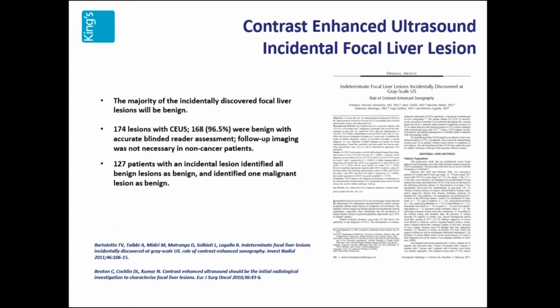And it's important to appreciate that in these patients who are not coming from an oncological background, that nearly all of these lesions will be benign. And this is where, as a radiologist or a physician, you are able to say to the patient, yes, this is a benign lesion, don't worry, with immediate effect. Otherwise, you have a patient who's going to go home and wait for further investigations to confirm that it's a benign lesion. And very often these benign lesions are hemangiomas. But beware these days, of course, the hemangioma is not as typical presentation, particularly in the fatty liver, as it used to be.